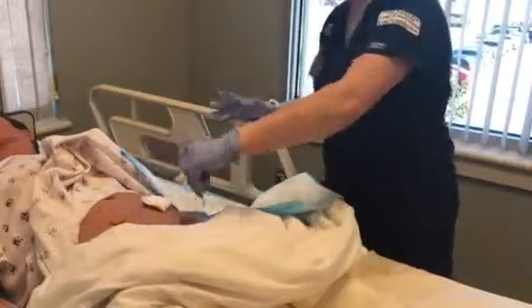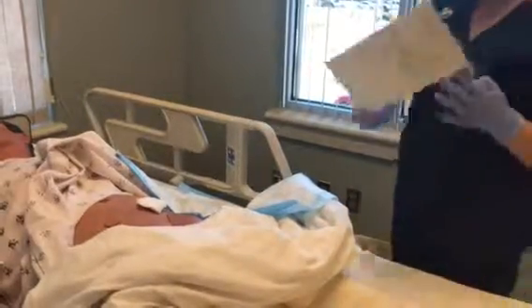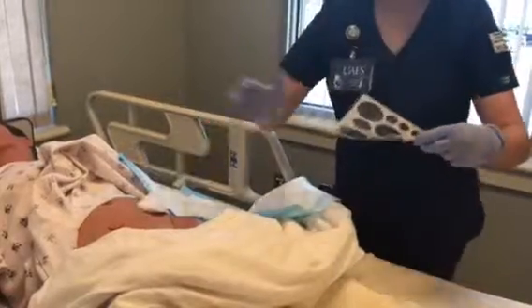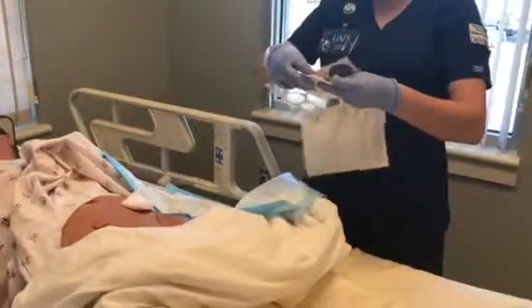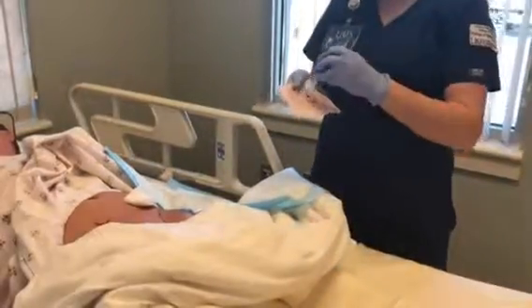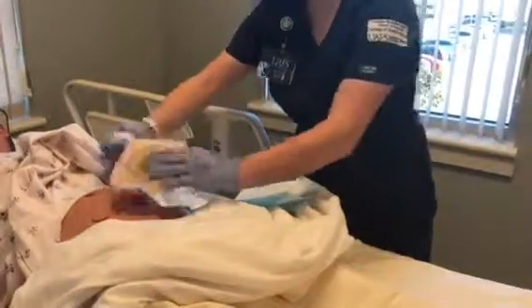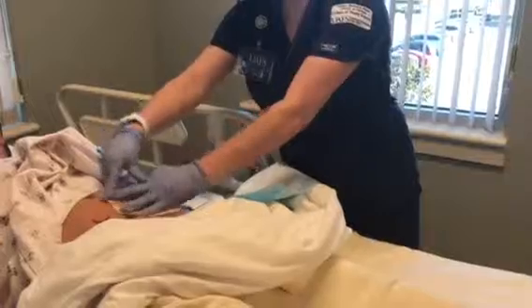And then I'm going to put skin protectant around it. And then I'm going to put it on the wafer and cut an eighth of an inch larger. And then I'm going to put the glue on there.